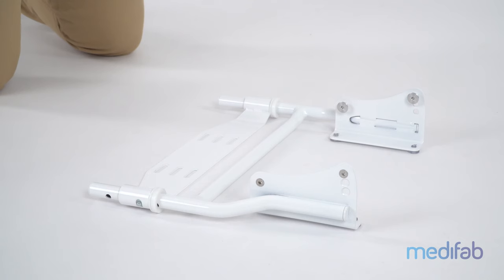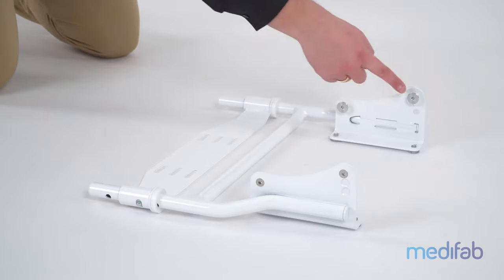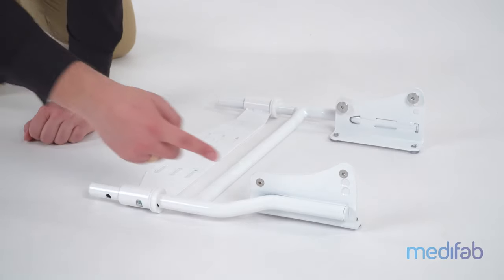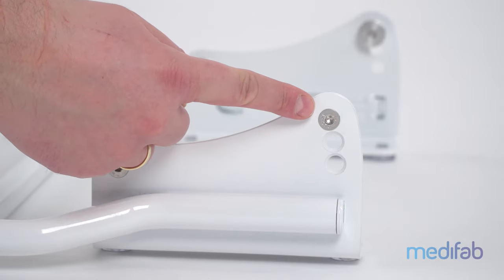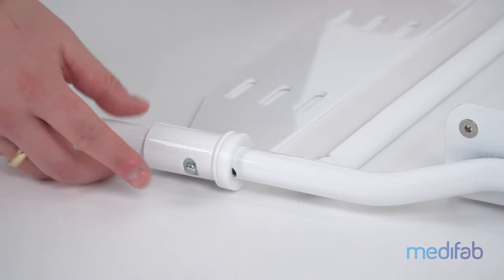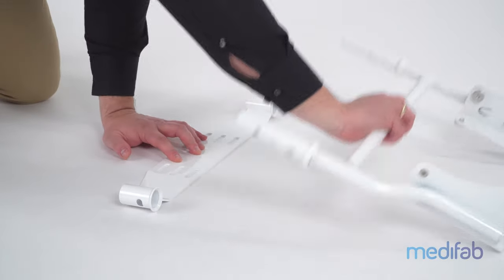The same applies for the toilet adapter. After the adapter plate has been installed on the toilet as required by the individual, the desired seat angle can now also be set. The frame can then be adjusted in depth or pulled off to the front to ensure ordinary use of the toilet.